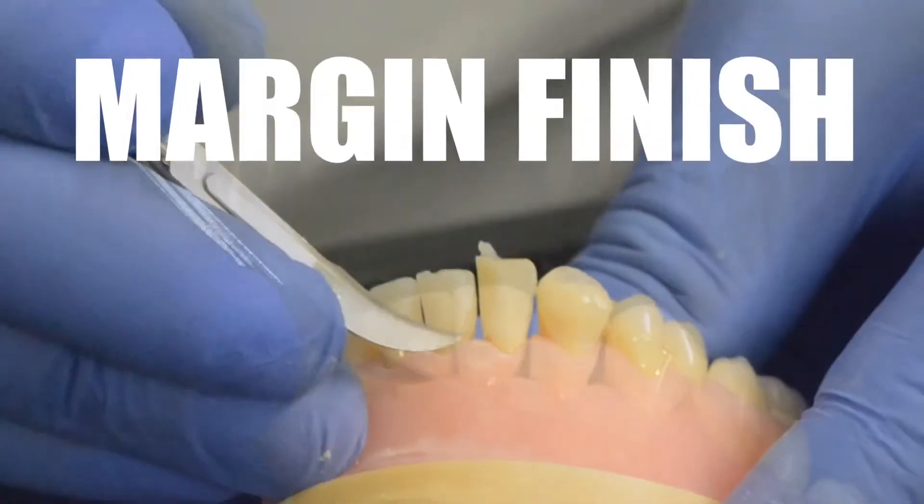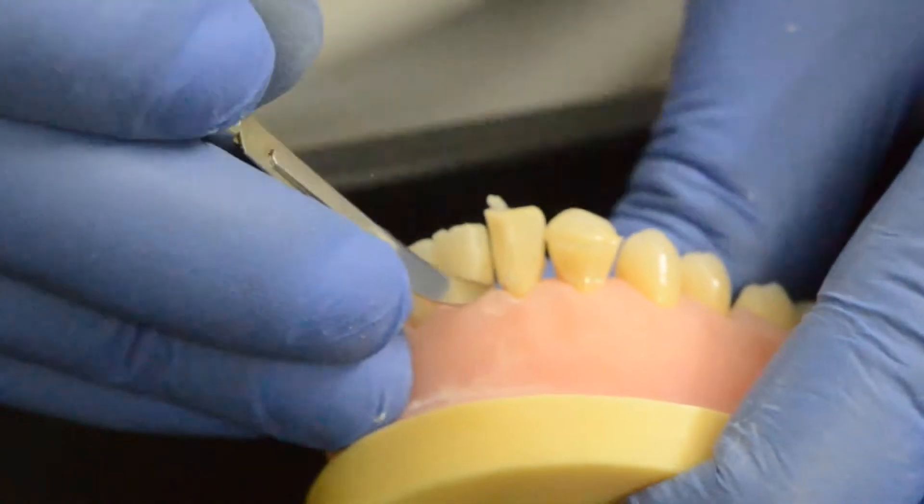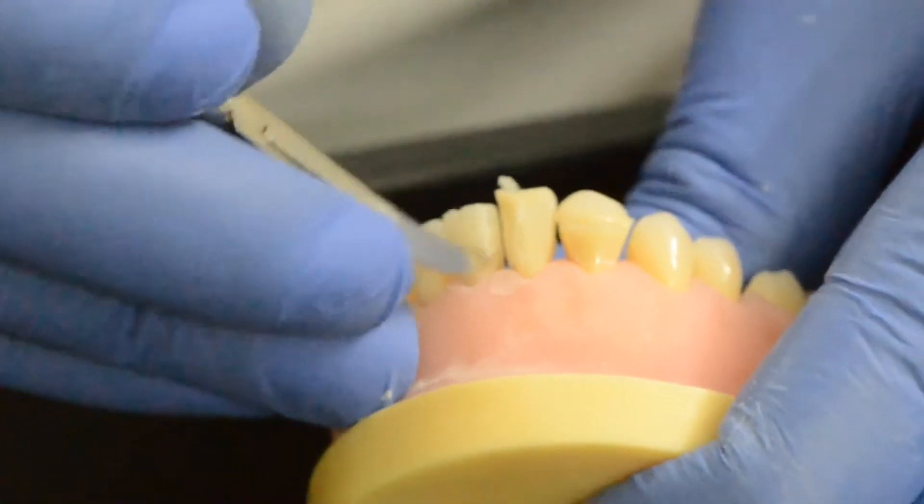We start with the number 12 blade, which is used for flash removal as well as finishing the margins with a gentle upward stroke so that you don't injure the gingiva.